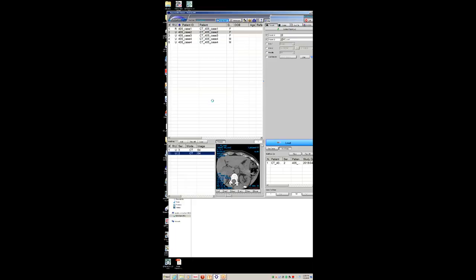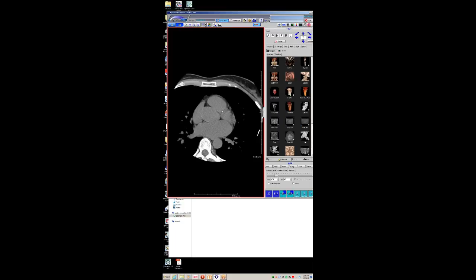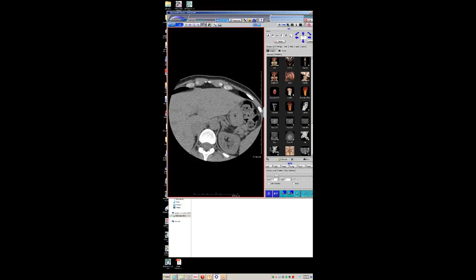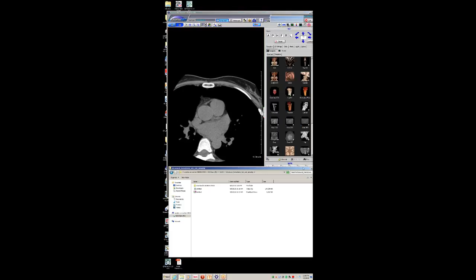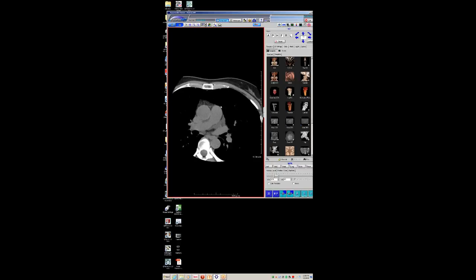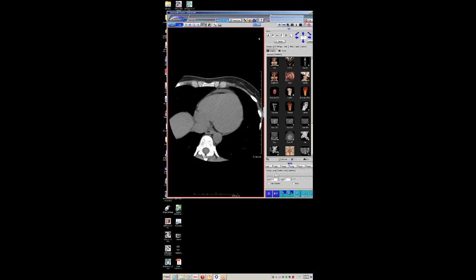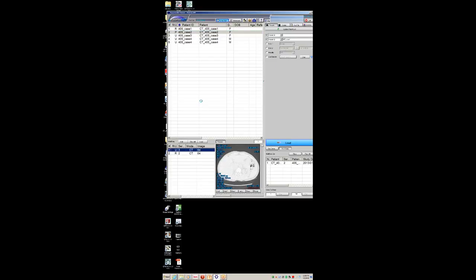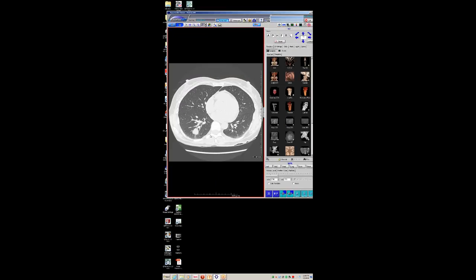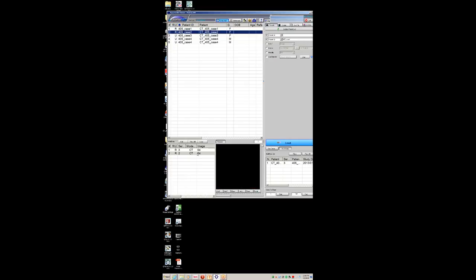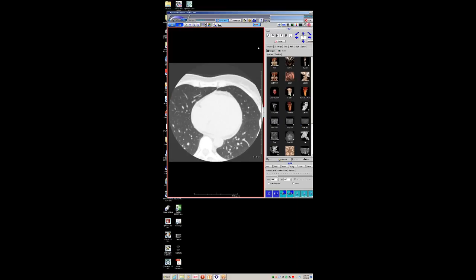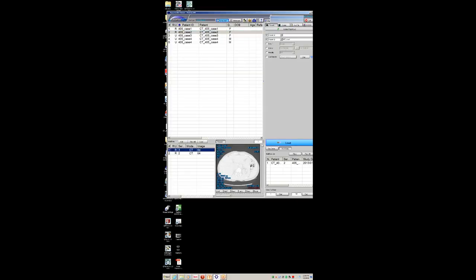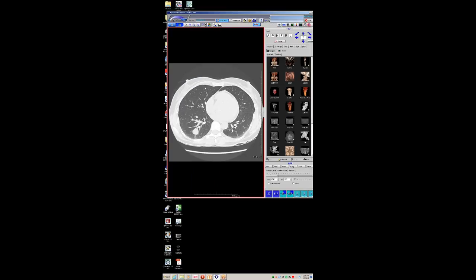This is a nice example of why I am a very strong proponent of imaging the full field of view on cardiac studies, let alone calcium scores. We do have cardiologists that read one day a week and they are very upset that they have to look at the full chest. But here's the full field of view — you can't see that on the limited calcium score view — and that was a lung cancer that was taken out and hadn't spread. A nice example of a lung cancer that would have been missed had we just done the limited field of view, which is what many non-radiologist colleagues want.